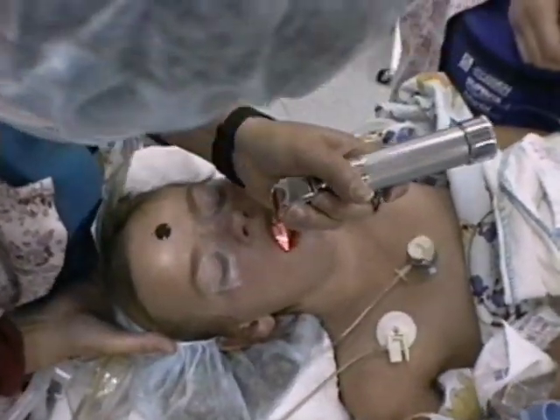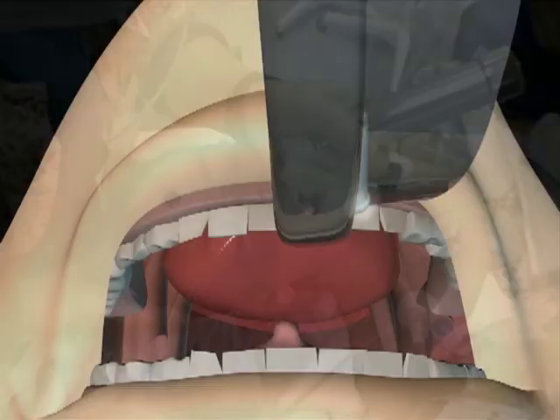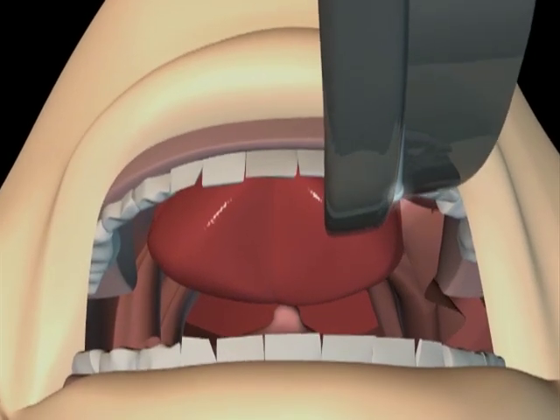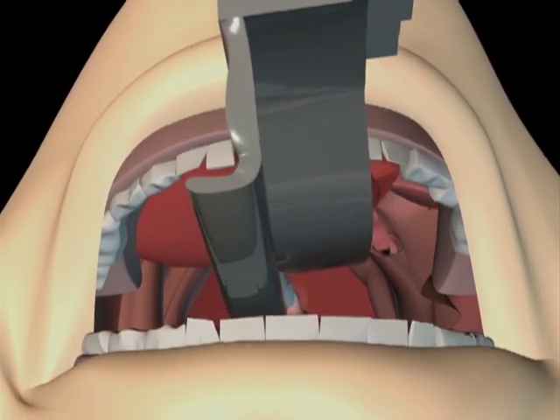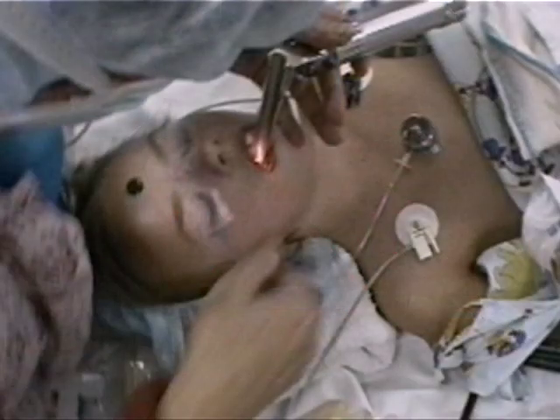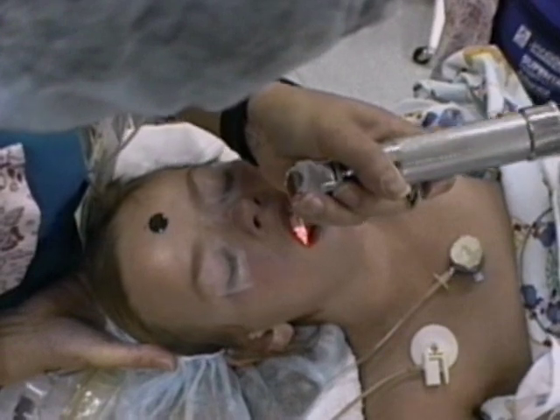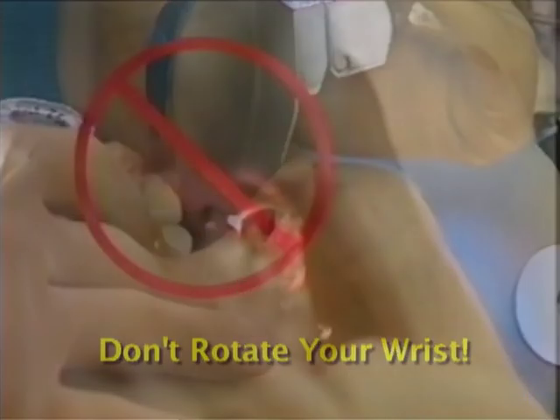Insert the blade as far to the right side of the mouth as you can, and then sweep the tongue to the left. Control of the tongue is essential, or you won't have room to pass the tube. Slowly lift the mandible upward as you advance. Be careful to avoid pinching the lower lip between the teeth and the blade as you lift. Also avoid using the upper gum line or teeth as a lever, or you will break teeth.